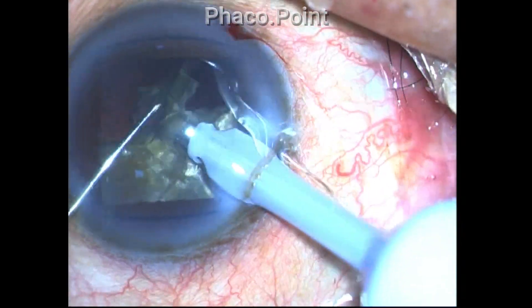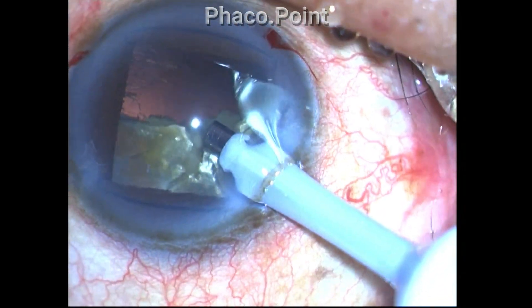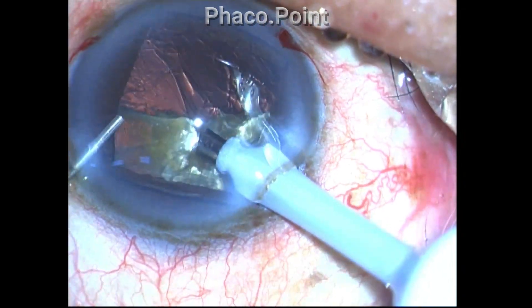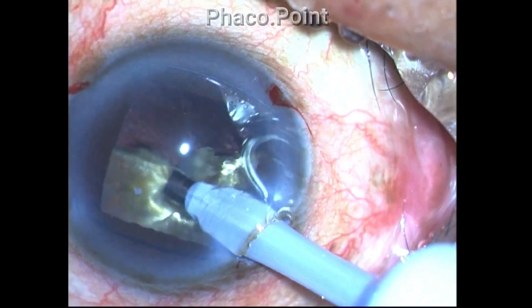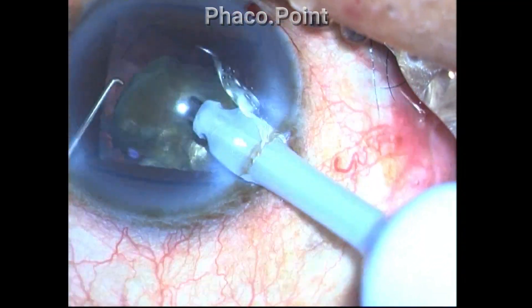Fragment removal is done by keeping the phaco tip steady in the center of the eye and applying a suitable amount of phaco power. A top-up of Viscoat is applied once again to coat and protect the endothelium, and the procedure continues.